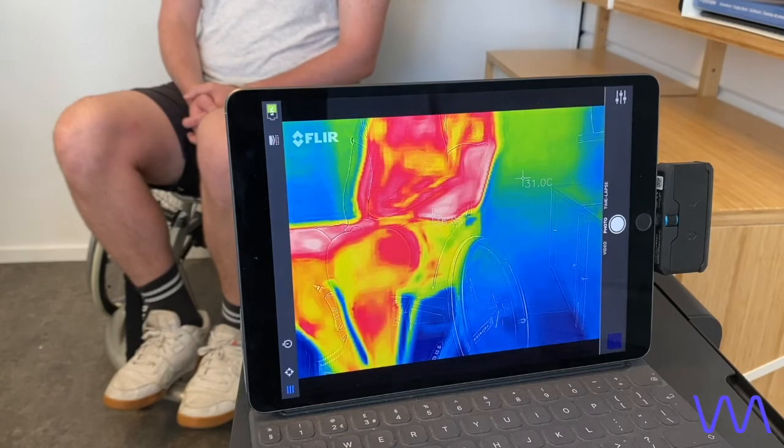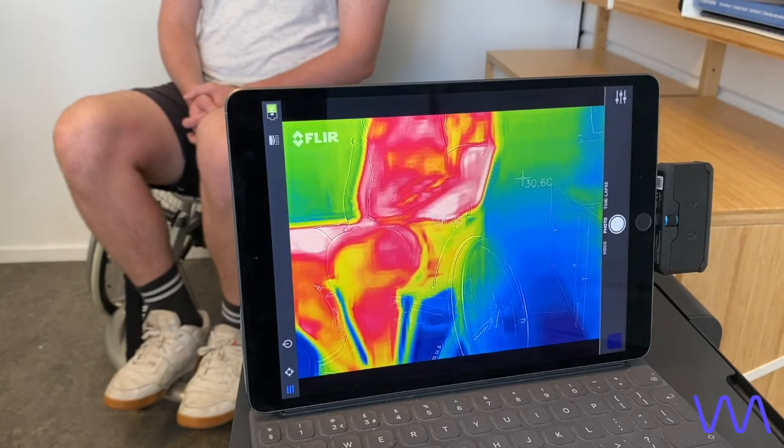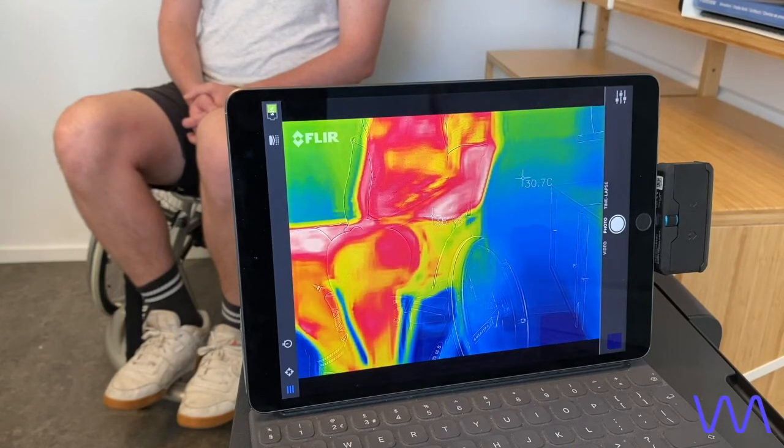So we're now going to wait about 10 minutes. You have a result after 3 minutes as well, but I just want to show you a bigger result, because obviously the longer, the more effect it has until it stabilizes. So we're now just going to wait 10 minutes and then do another temperature check.